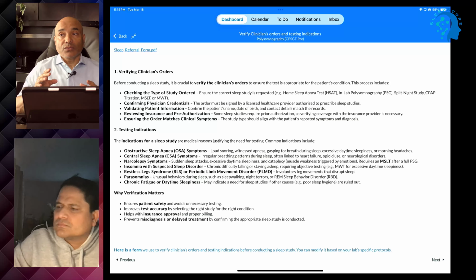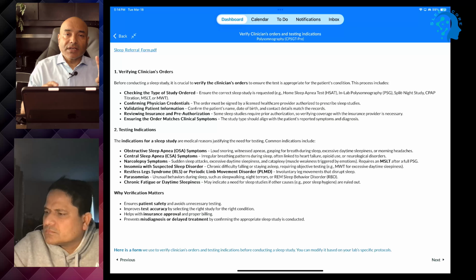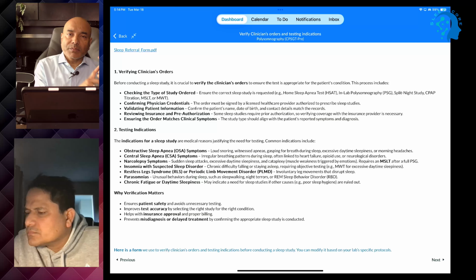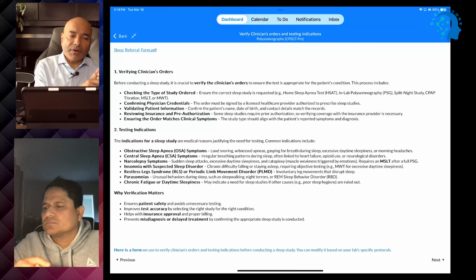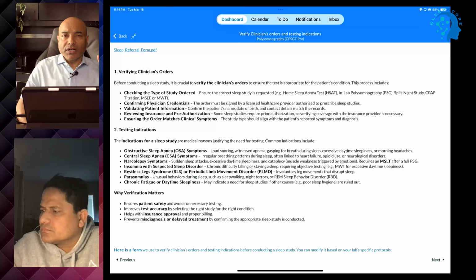We need to know. Normally, how many types of sleep studies are given here? Home sleep study, in-lab sleep study, split test, CPAP, MSLT, MWT. So there are 6 different types of sleep studies, right? The first is home sleep study, which is done in the house.